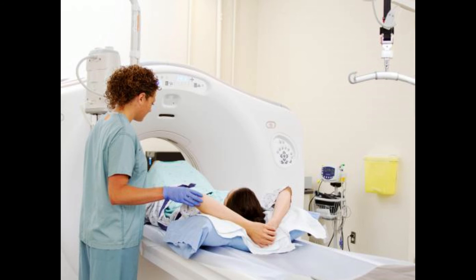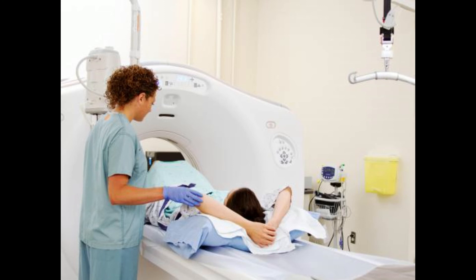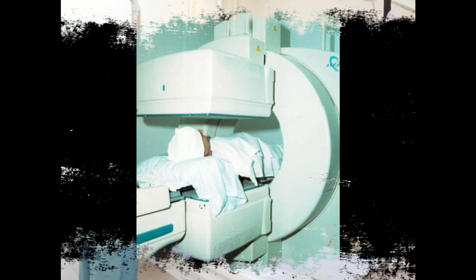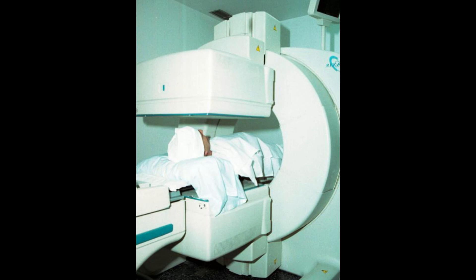As the FDG breaks down, it emits a particle called a positron, which then splits up into two photons. It is the photons produced by the FDG that the PET scanner detects. As the FDG congregates in highly active cells like tumors, most of the photons come from those areas.